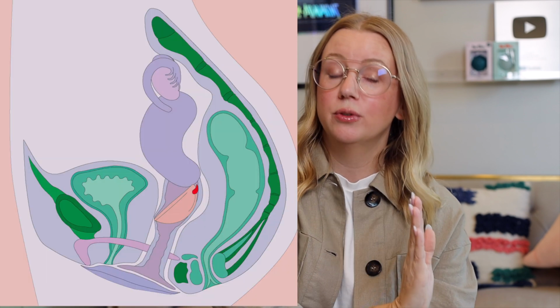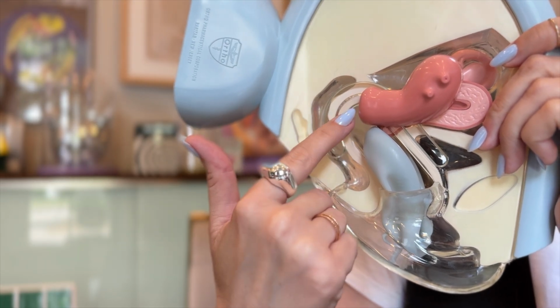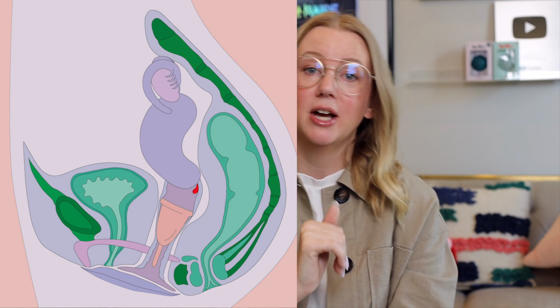If you have a retroverted, backwards facing uterus that is close to the back wall of the vagina, a menstrual disc actually probably isn't going to work for you because it cannot tuck. I talked about that in one of my most recent videos. So then it means a menstrual cup is probably better for you. It sits underneath the cervix, so it doesn't have to tuck behind it. The fact that it's tilted towards the back of the vagina means that the disc isn't going to work, but the cup can work. It can sit just below the cervix.